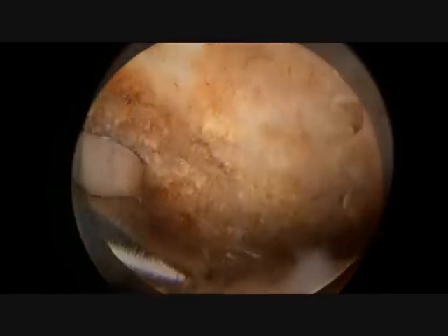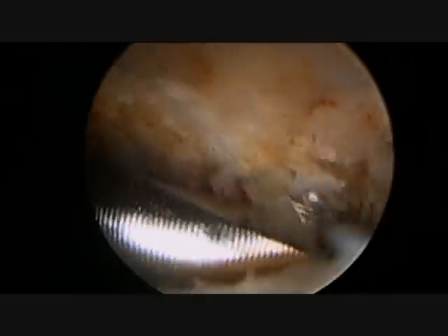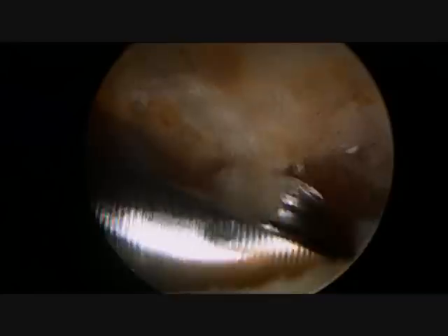Once this is completed, a 4mm burr is used to remove the bone spur in a coordinated fashion. Since most of the pressure on the rotator cuff occurs laterally, I start the decompression on the outside and work my way towards the middle.